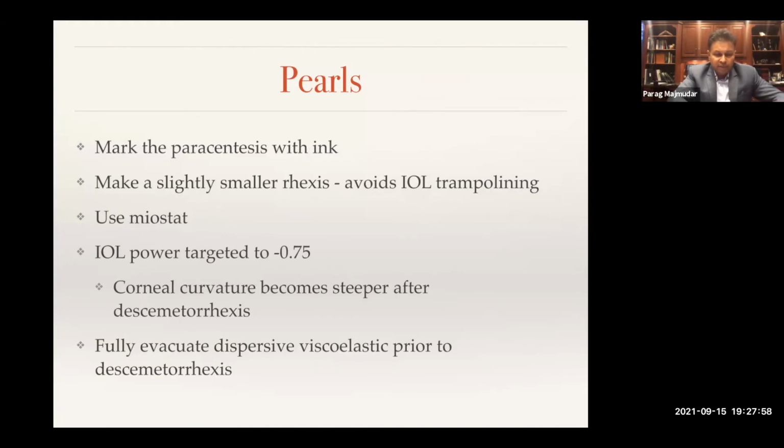And the last thing I'll share as a pearl is that I got so wrapped up in my first combined procedure, I will never forget it. The patient had cataract surgery, and I think I probably forgot to evacuate all of the viscoelastic out of the eye behind the iris when I was doing my cornea. I jumped right into the cornea, and I did a beautiful DMEK. It came out perfectly, but of course, the patient had pupillary block or issues with the retained viscoelastic.